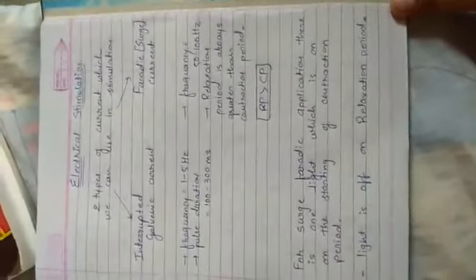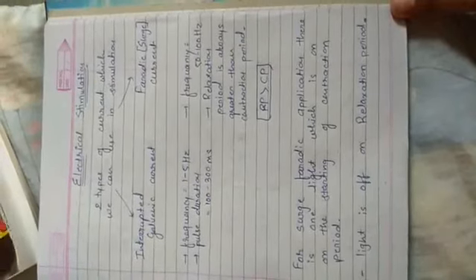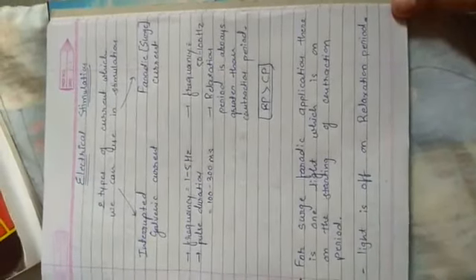We have to increase the intensity when the contraction period starts. It means when the light is on, we have to increase the intensity. If we increase the intensity in a rest period, it leads to chances of electric shock.